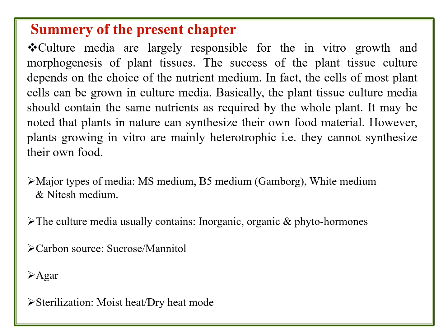The carbon source included in the media preparation is either sucrose or mannitol. Sucrose or mannitol are the prime choice for media preparation, because sucrose has to be hydrolyzed in the plant cell itself. And of course, mannitol is also used as a carbon source for growth and development.